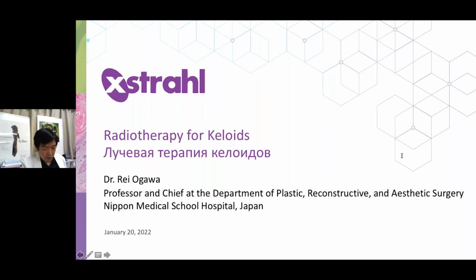Yes, actually I have used electron beam, because electron beam therapy can be covered by health insurance in Japan. Okay, great. And are you also treating hemangiomas? And if so, what are the doses? So actually, for hemangioma in Japan, we don't use radiotherapy, because drug medication and laser therapy can be used for hemangioma. So for hemangioma, we don't need radiotherapy at this time.